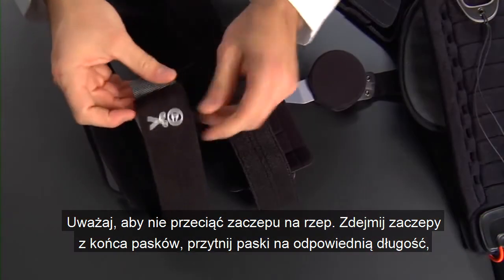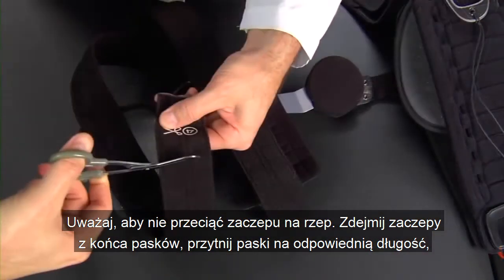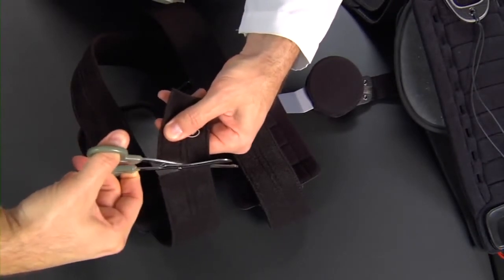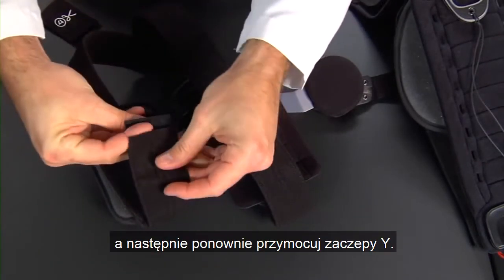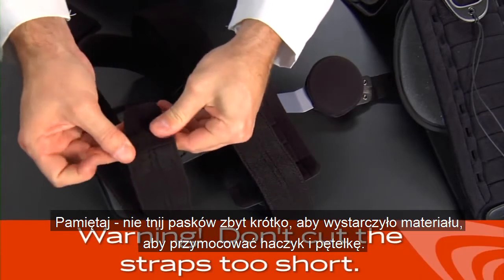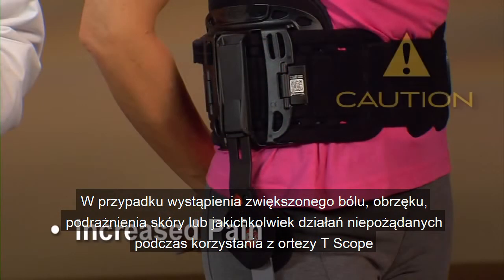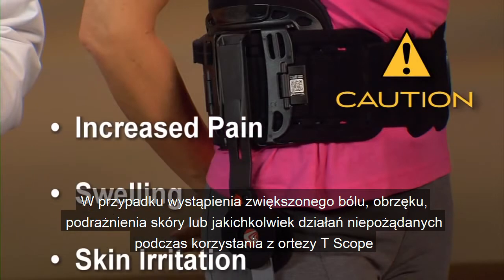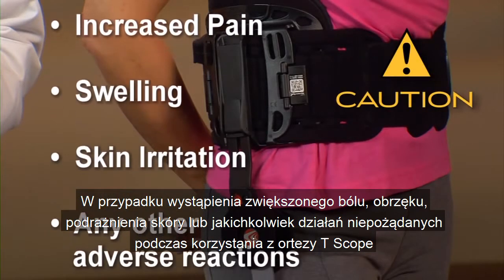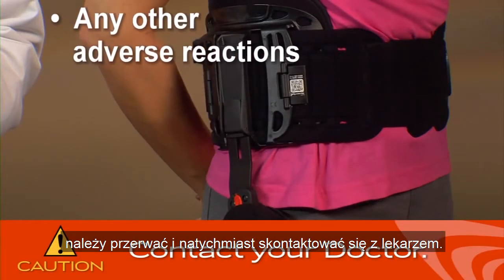Remove the Y-tabs from the end of the straps, cut the straps to the right length for you, then reattach the Y-tabs. Here's something to remember: don't cut the straps too short so that there isn't enough material to affix the hook and loop. Be careful not to cut the hook and loop tab. If you experience any increased pain, swelling, skin irritation, or any adverse reactions when using a T-Scope hip brace, stop using the brace and contact your doctor immediately.